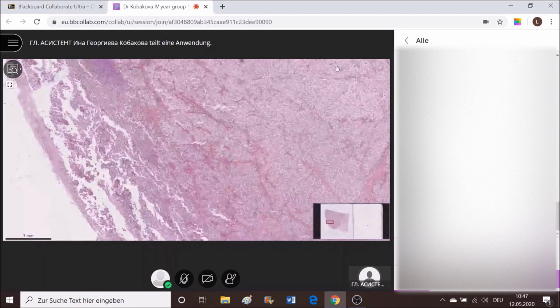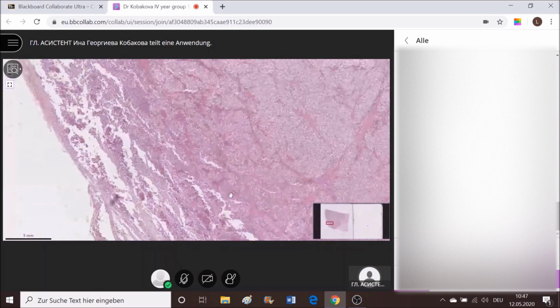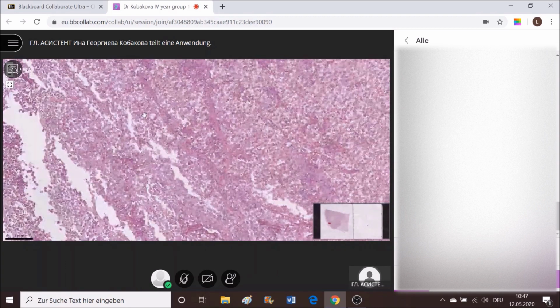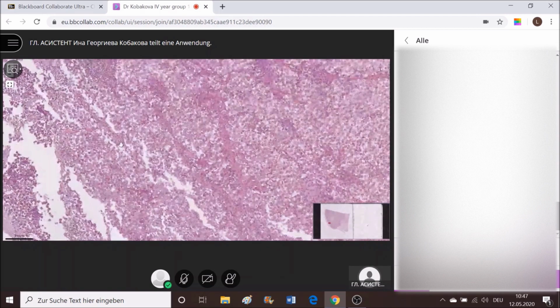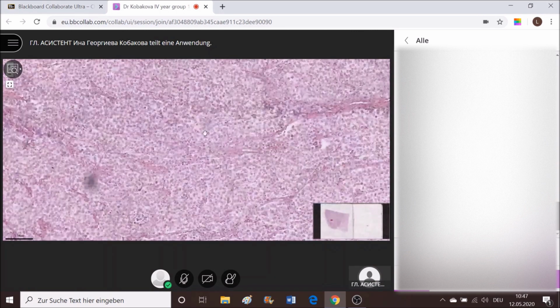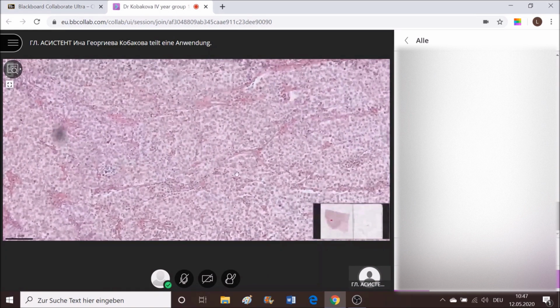Pay attention also on the idea that there are fields in this tumor which are suffering necrosis. They're appearing a little bit more vague, if you will, lighter than the other ones. And majorly, the population of tumor cells is pretty equal.